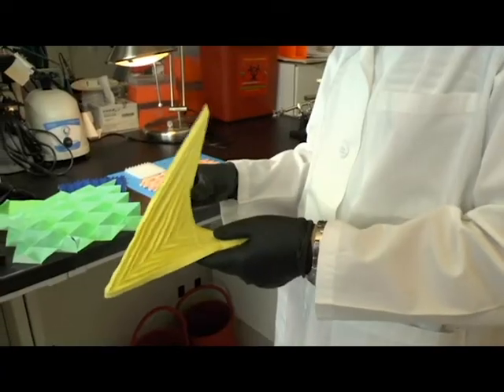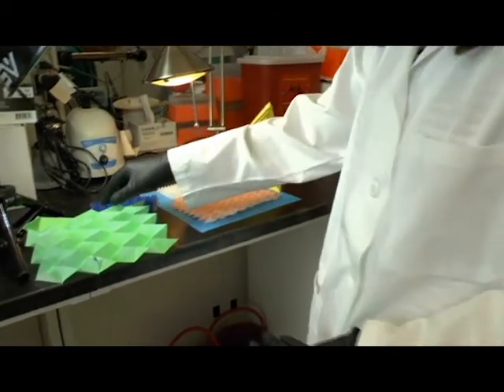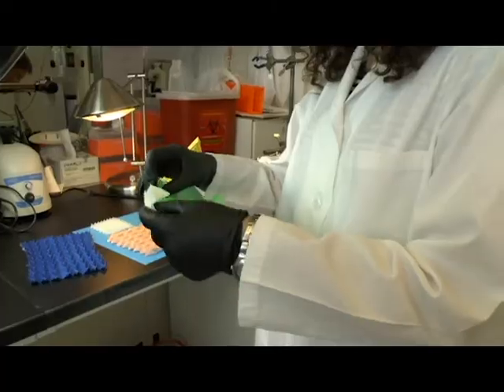get chemotherapy. So what we were trying to do is come up with a way to get as much drug as possible and as much surface area as is possible in the belly, in that space, but passing it through really tiny tools, because we don't want the patient to have to go through a very invasive surgery and open them up again to put a huge kind of device in there.